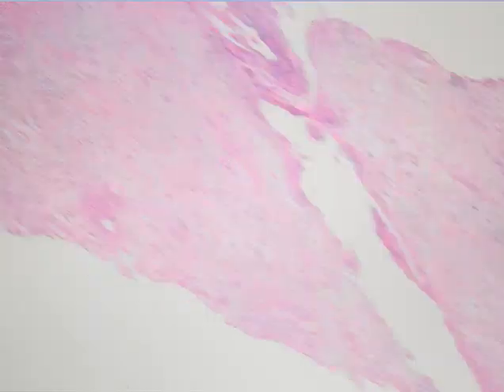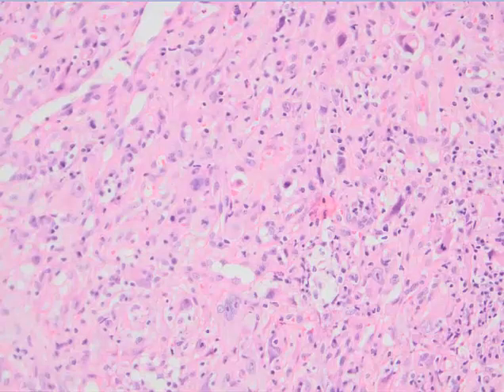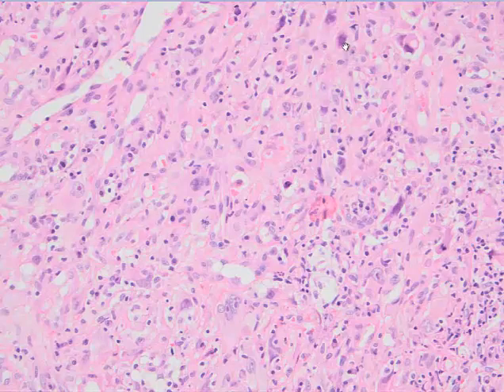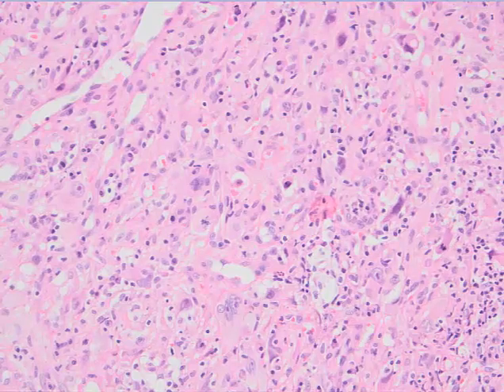And again, I'm going to show you another biopsy with clearly atypical epithelioid cells with again some mitotic activity. Yes, here they are. So we have these mitotic figures and hyperchromatic large cells. Some of them are spindle cells, and again another mitotic figure here.